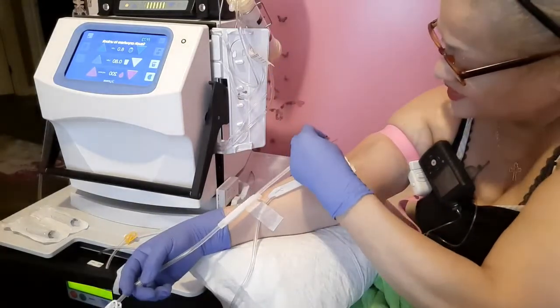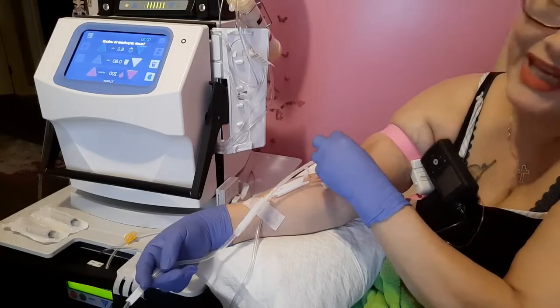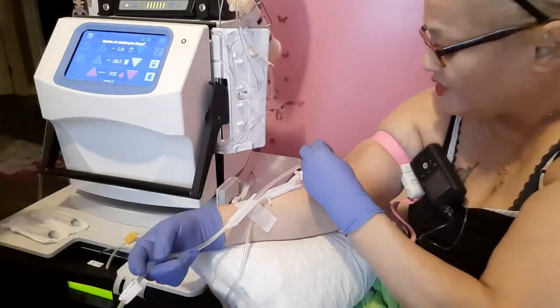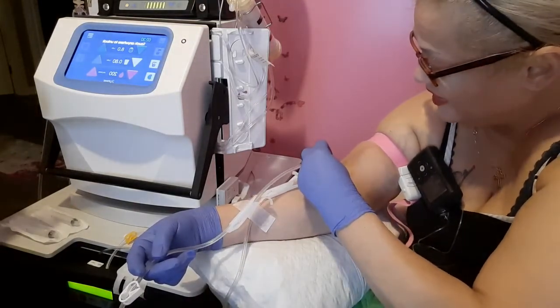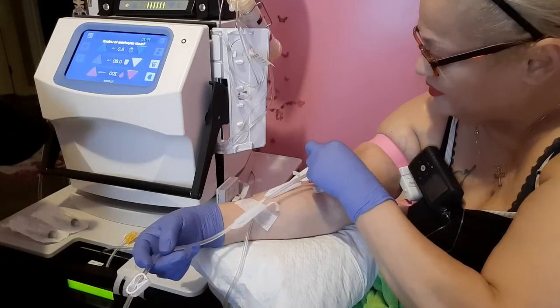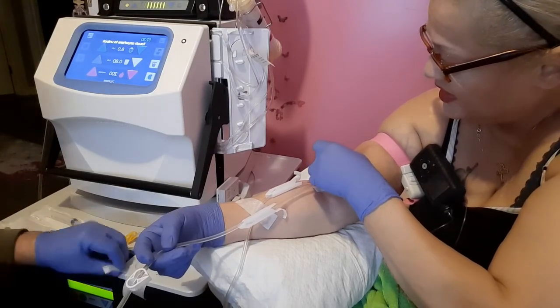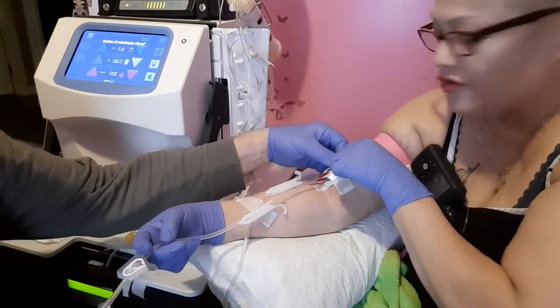Alright. Now this one's a little different. This one's deeper in, so I have to go at a different angle. But once I get my flash, then I know I'm in, then I can straighten it out and land the plane. So Hofstra is just going to look for the flash and he'll let me know, because I can't see at this point. Flash. So now I'm landing the plane. And Hofstra is going to take down my wings for me. He's going to ground me.